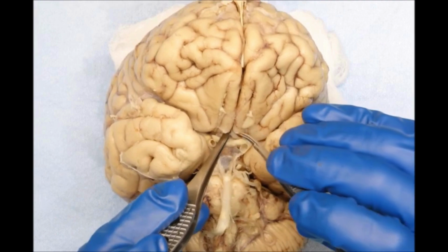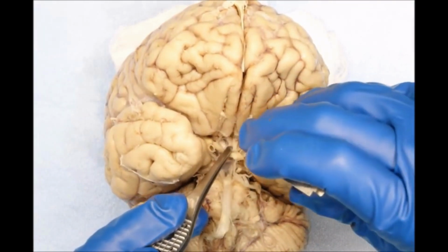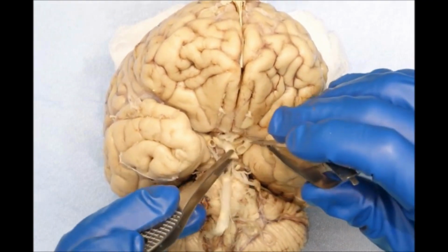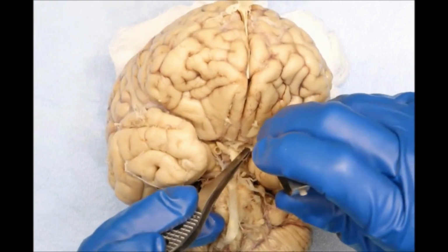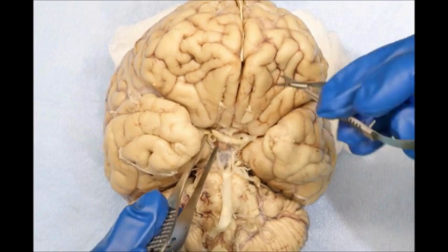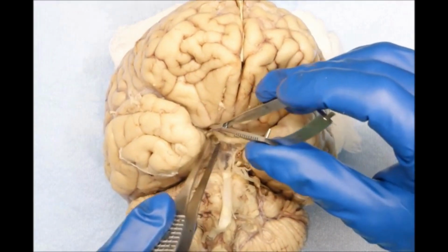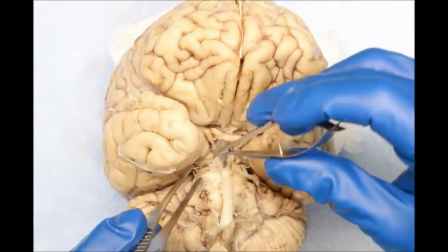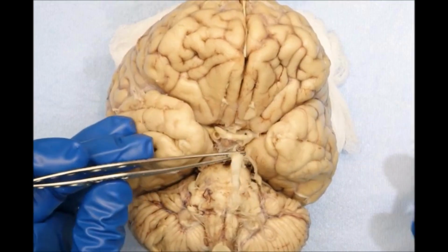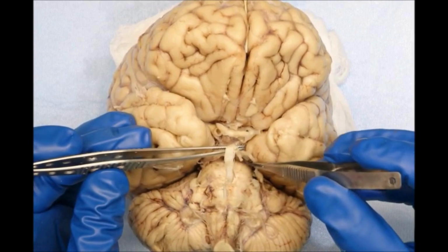Now I'm going to make sure, once again, I've got those anterior cerebral arteries, and I'm going to pull it over the top of the optic nerves and try to free up all those structures there. I just got to finish holding on to the right optic nerve and the right internal carotid arteries.